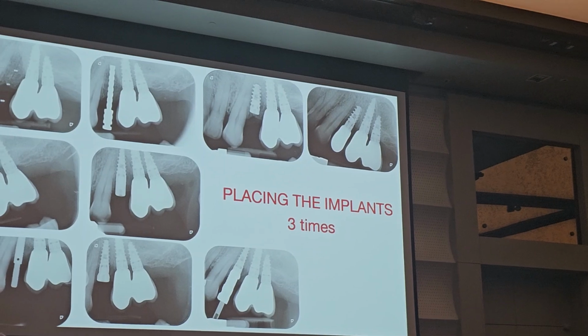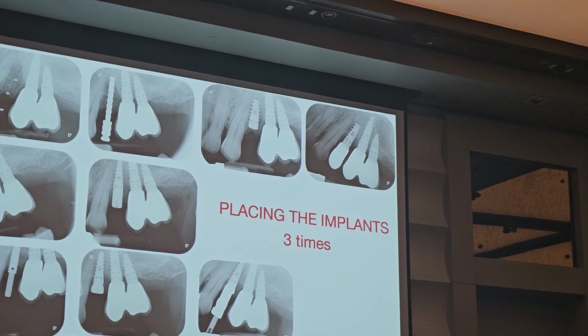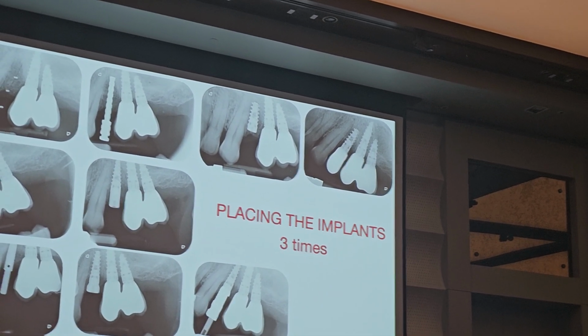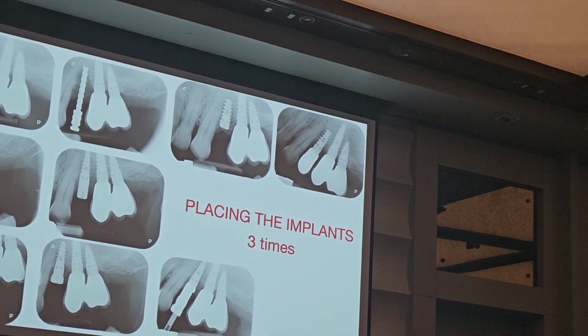You know, in this patient, I had to place the implants 3 times. I placed the implants, did the healing, did the impression, screwed the abutment, 3 months, mobilization. Again, wait, another implant, another 3 months, another abutment, after 3 months, again. Till the third implant, okay, still in the mouth.